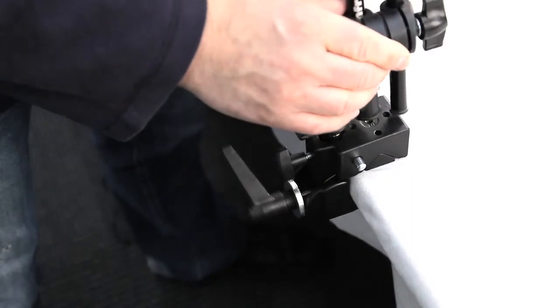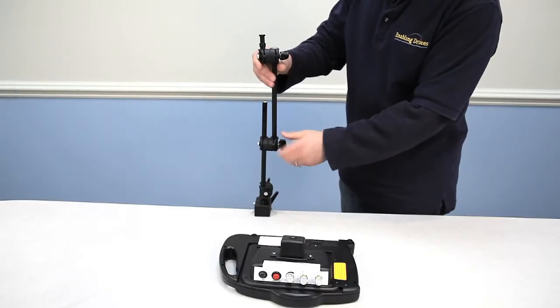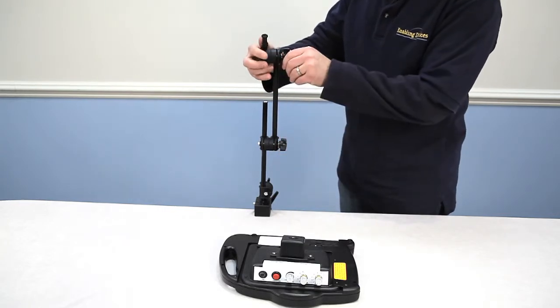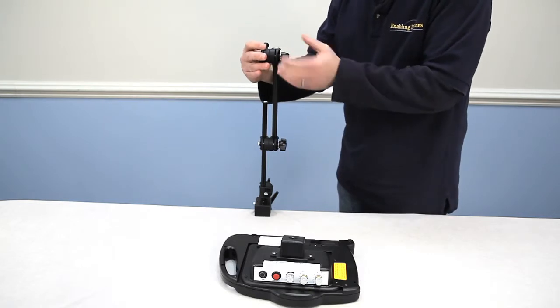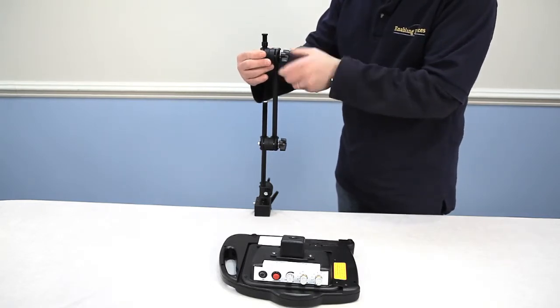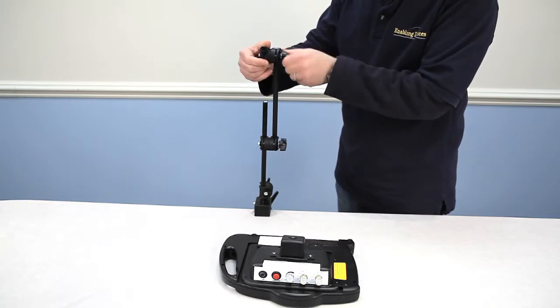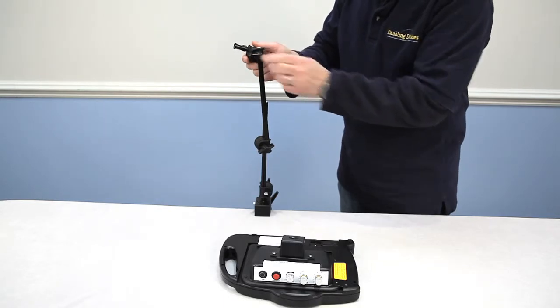Loosen up the set knobs on the arm. I'm going to do a basic adjustment — bring this arm up a little bit and tighten it in place. This also pivots on the top for your communicator, so you can tip it toward the person or tip it back, whatever you need. I'm going to angle this for the camera so you can see me mount the device.